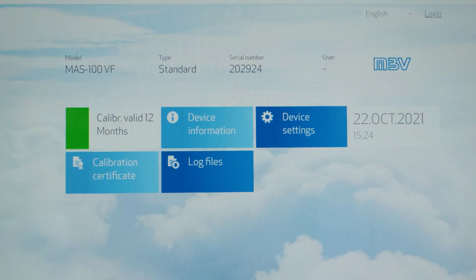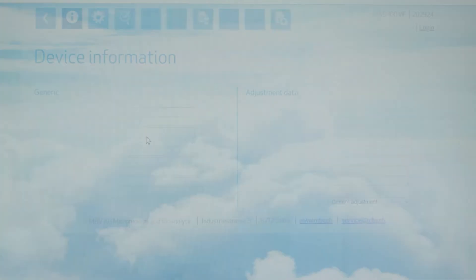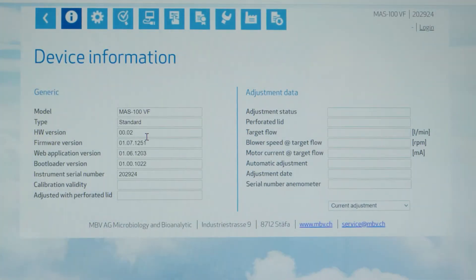On the home page you see the connected instrument type, its serial number, date, time, and the remaining validity of the calibration certificate. In the tab device information you can access information on serial number, firmware version, and other technical information.